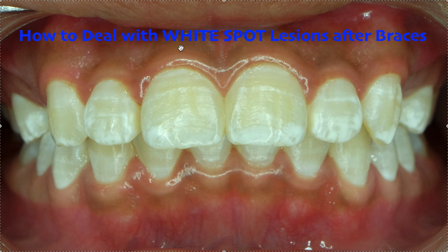And then after that, you could try something else. There's a variety of different products to help. I think one of the newer ones, well, not new, but that's really gotten good, is Icon. Again, I don't do this, but it is a procedure that is done in the office. You do have to put a rubber dam on, because you can't touch the gums. You can use an actual rubber dam or these kind of liquid rubber dams that you put on, but it definitely is not something that can be done at home.